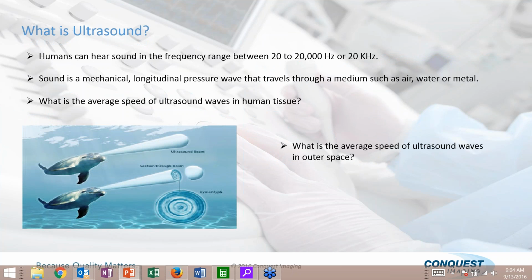So sound is essentially a mechanical longitudinal pressure wave that travels through a certain medium. In fact, the vast majority of ultrasound systems have a dashboard that shows how much mechanical index, or MI, we're putting into the human body, and that's important for safety reasons.